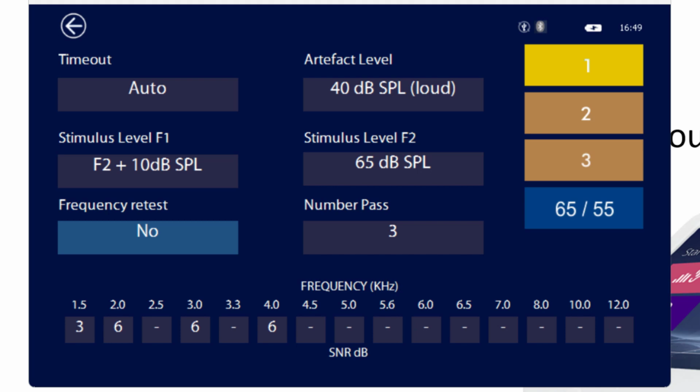So there is not really everywhere good attention for what it does to the statistics. And I would not do the retest if it's a screening protocol. I would just rely on the 4 frequencies. If there is a clear reason why it failed, you just retry the full test instead of allowing it to test each frequency on a different one with an offset.